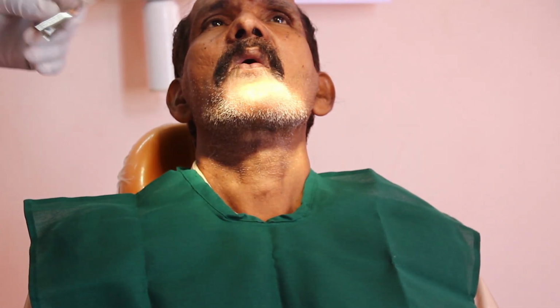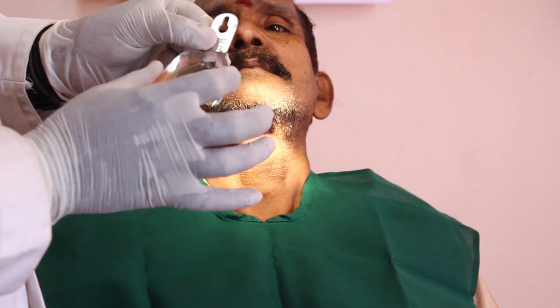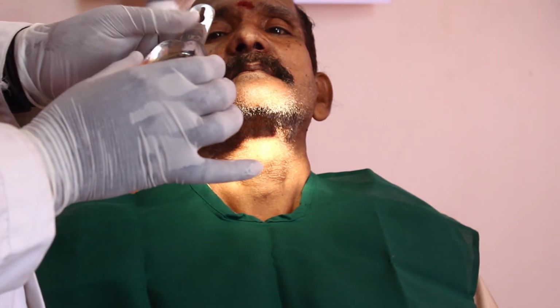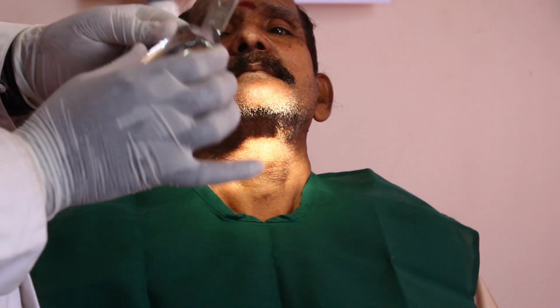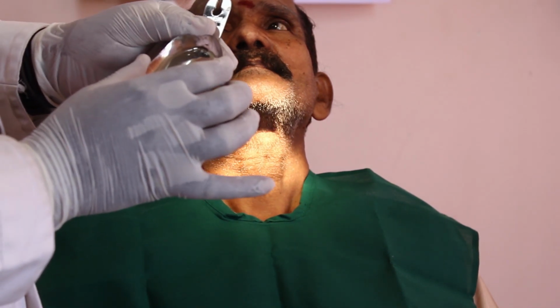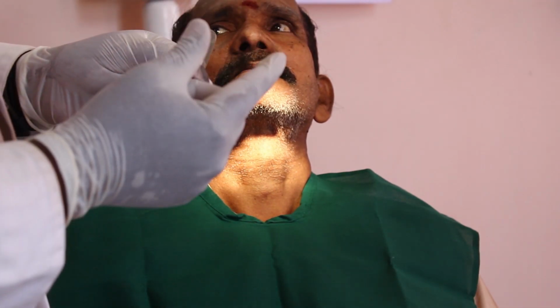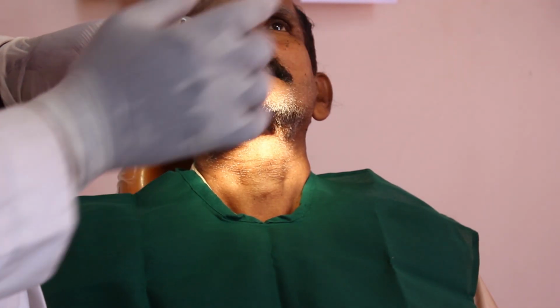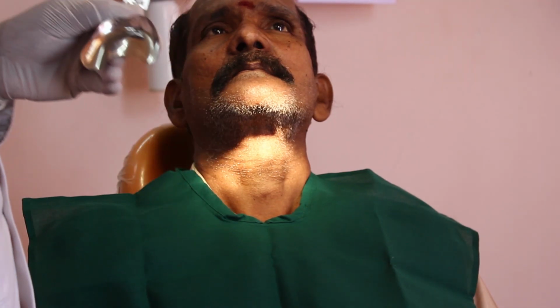So for selecting a tray, you have to select according to the width of the upper alveolar ridge. Corresponding to that, you have to choose the tray. Tentatively, by seeing the ridge, I am choosing this U2 tray, and I am going to see whether the size is suitable for the particular patient. You can use the divider to measure the width between the two alveolar ridges, and you can overlap it on the tray size for selecting the suitable tray.